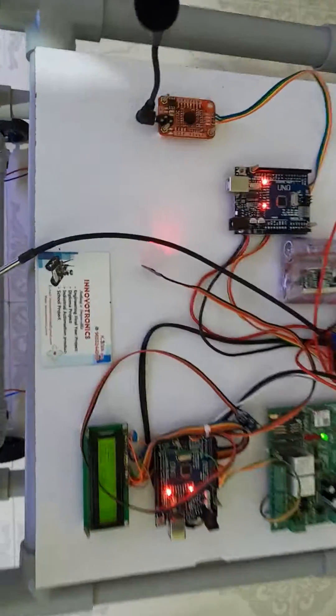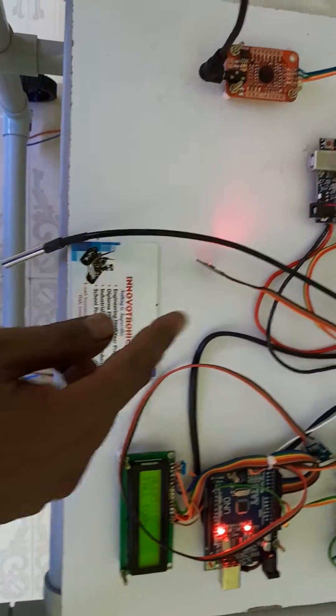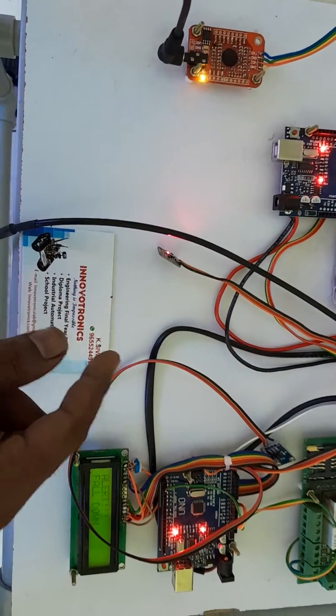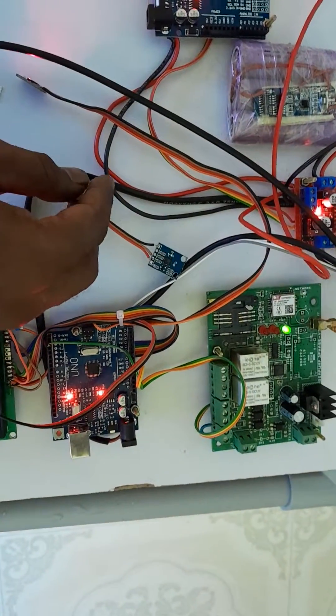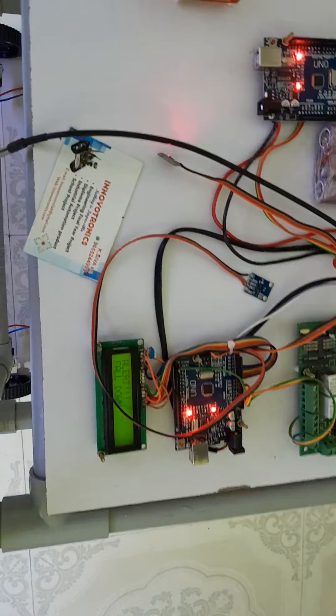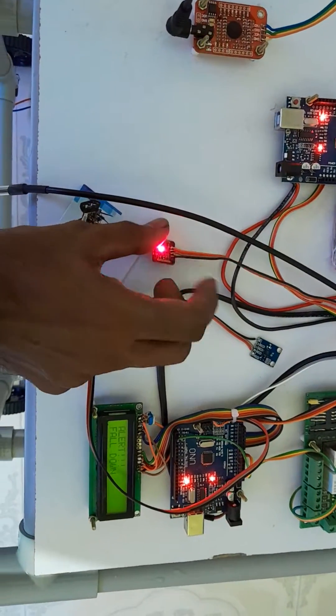Here you can see one temperature sensor and one SpO2 sensor. The SpO2 sensor is used to measure the person's SpO2 level as well as heartbeat. We also added a position sensor — if the wheelchair falls down, the system will automatically identify it and send an SMS.